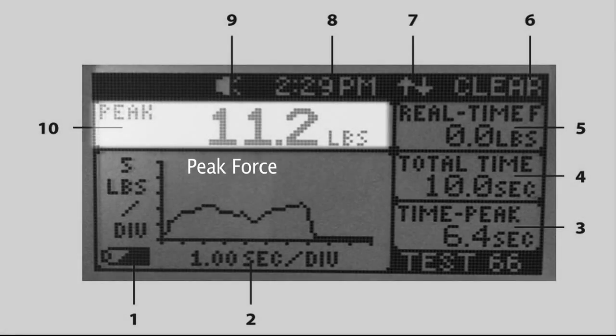Item ten is peak force. The peak force displays the maximum force recorded during the test and shows which units the force is being measured in — pounds, kilograms, or newtons.